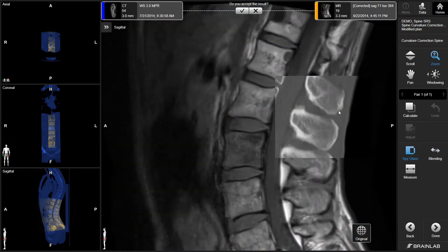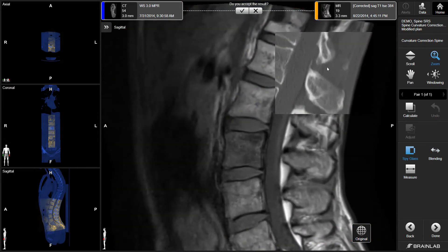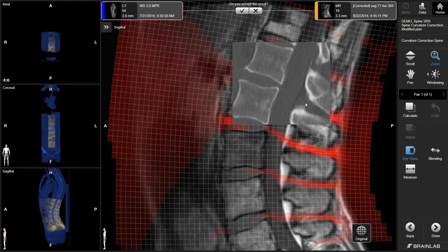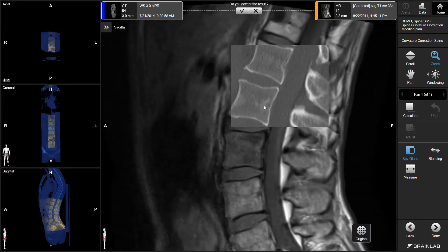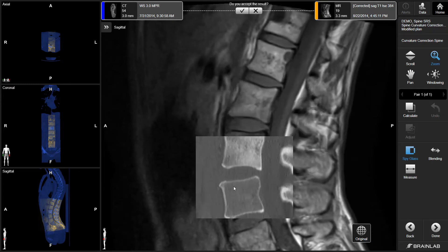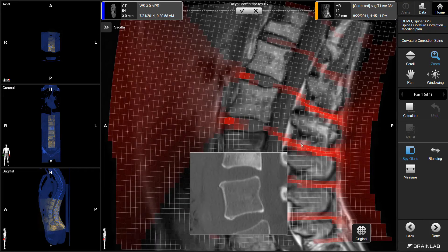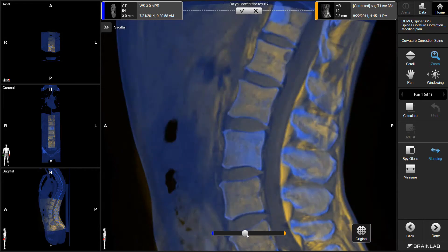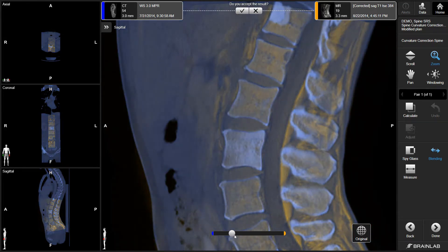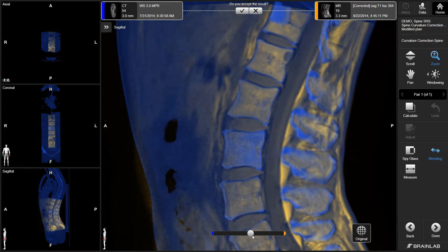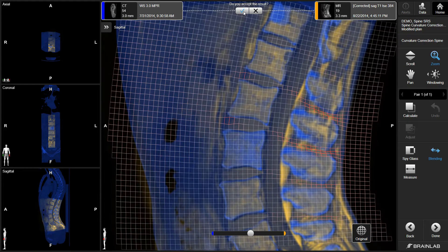The Spyglass view shows the regions exposed to highly concentrated deformation in red, like the disk locations. In the Blending view, the fused result can be compared with the original scans. After reviewing and approving the fusion, targets can be easily defined on the newly generated image set.